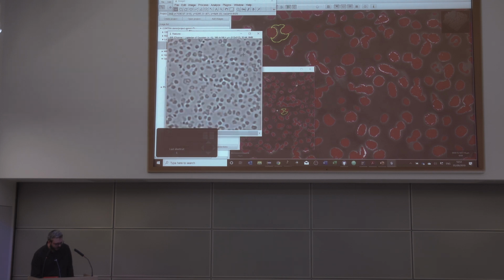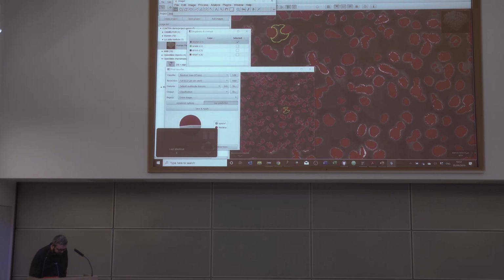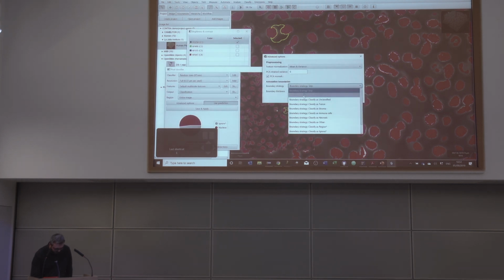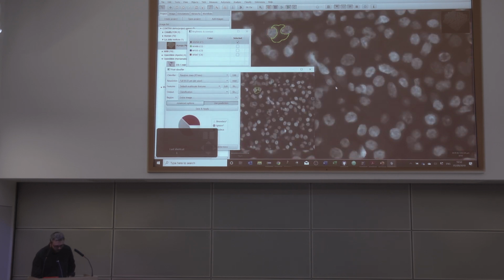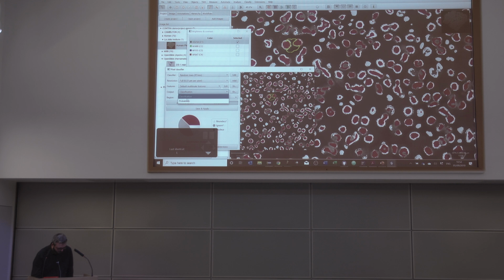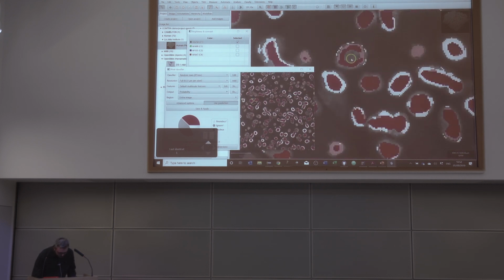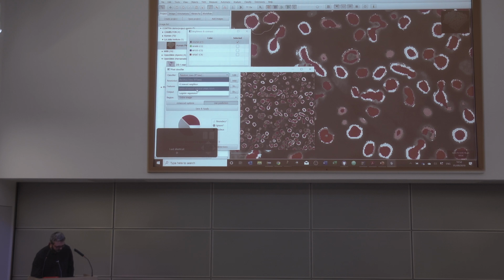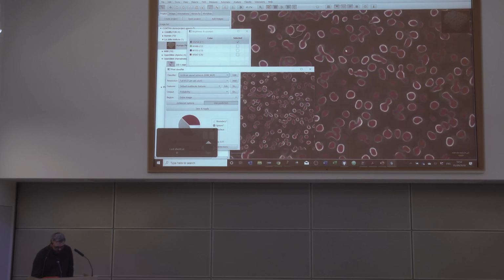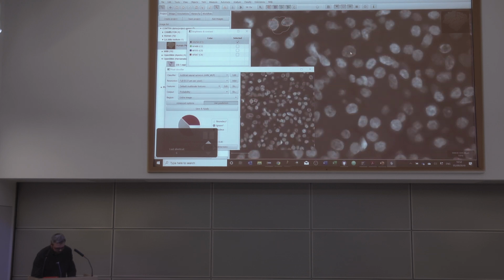And you can see that maybe there's a chance that it will be able to identify the boundaries between nuclei as well. So a new option added in the last day or two allows us to train a classifier that also attempts to learn the separation between cells. And we can output that, say, as probability. It may not be too convincing yet, but we can also change the type of classifier that we're training until we come up with something that actually is more capable of the job.